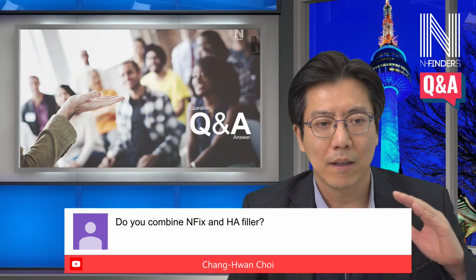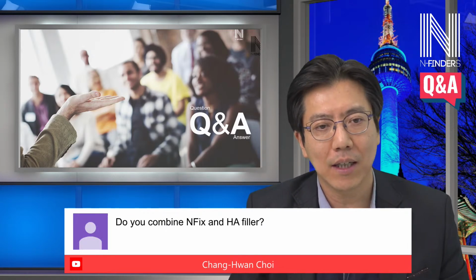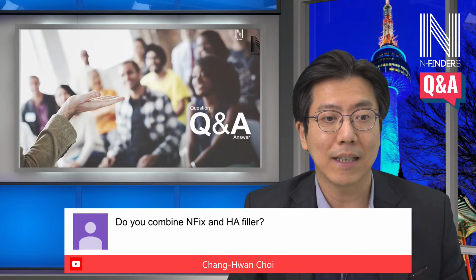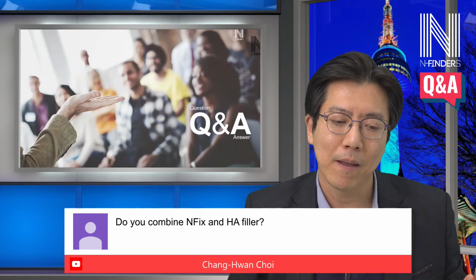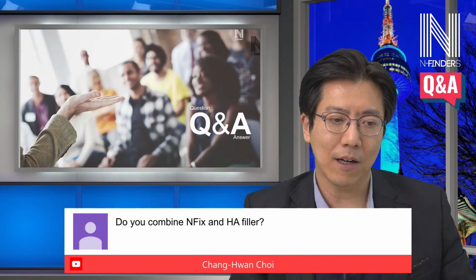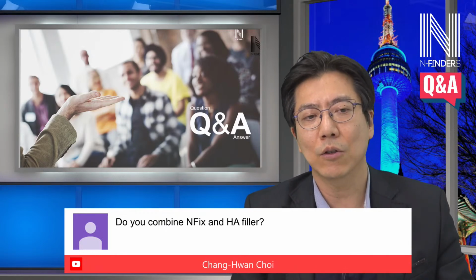For example, if I want to enhance deep fat compartment volume, definitely I put some filler into the deep layers, but I do not inject filler into the subcutaneous layer when I put the thread into the subcutaneous layer. So when the target layer for fillers and the target layer for thread are different, I can do them together. And I always do filler first.